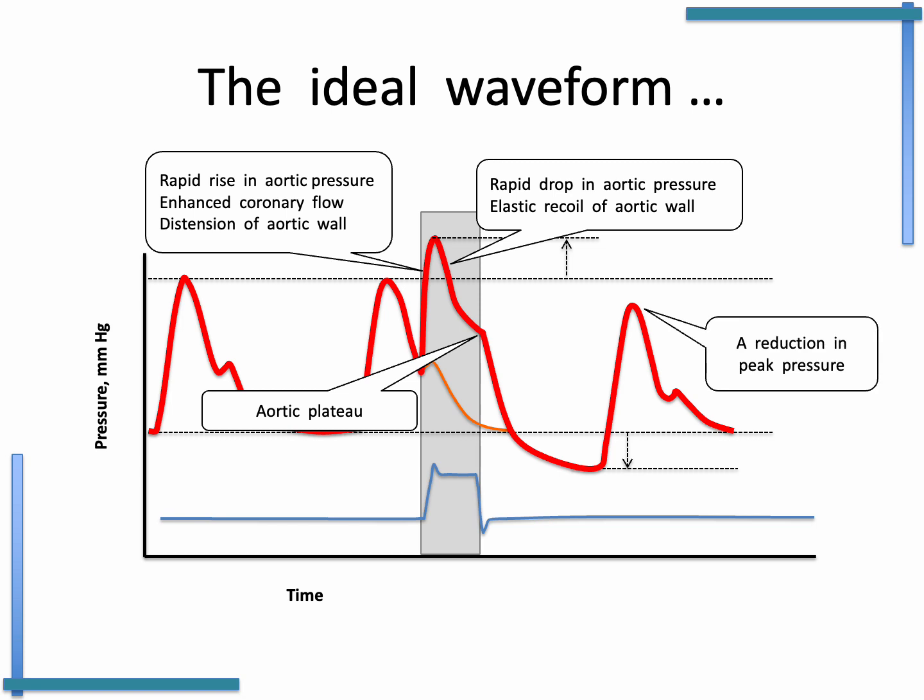And we see now in the beat following the deployment of the balloon pump that we have a reduction in peak systolic pressure. And as I showed on my slide earlier, that would reduce the systolic tension time index for that following beat.